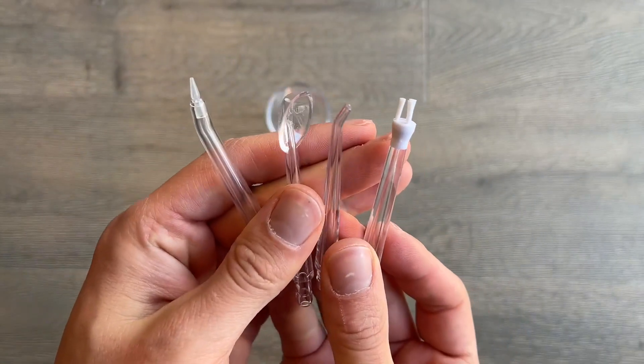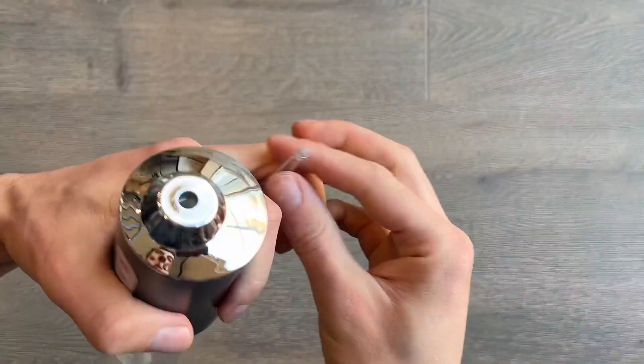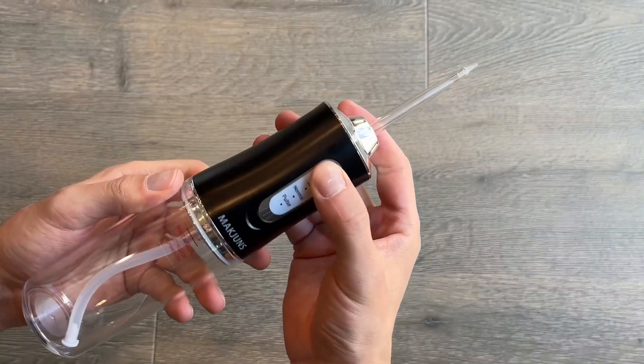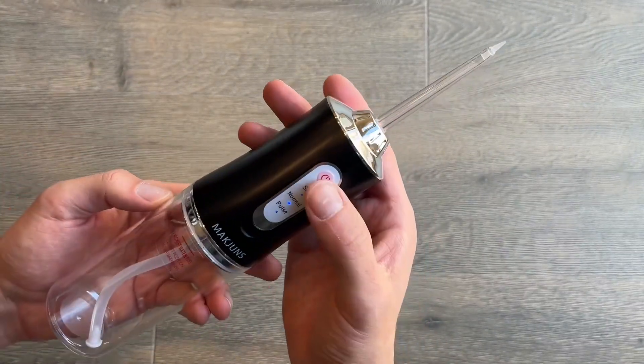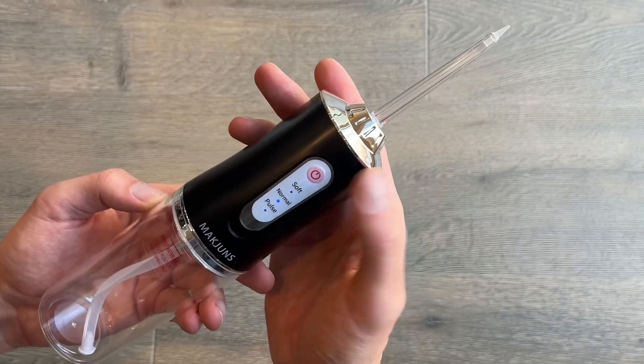The base just twists on the bottom and has a plastic design to keep water in place without leaking. When fully charged and used in normal amounts, it can be used continuously for about three weeks or 21 days, which is extremely impressive.